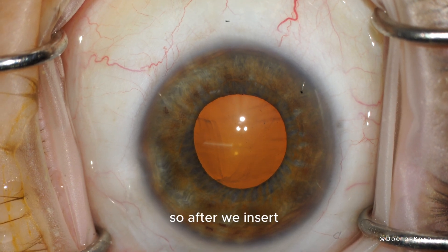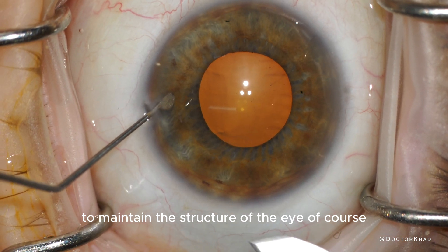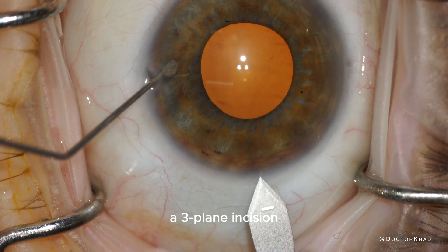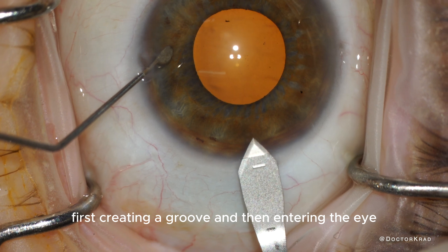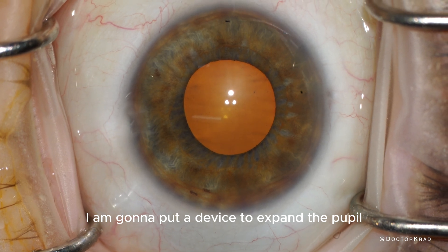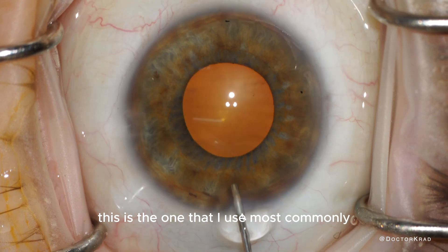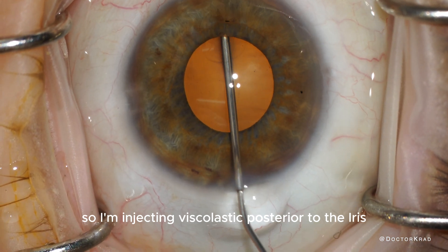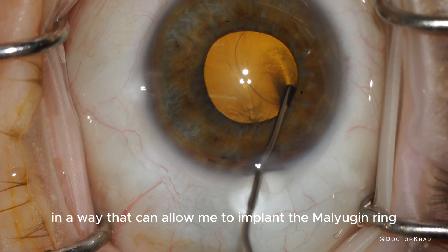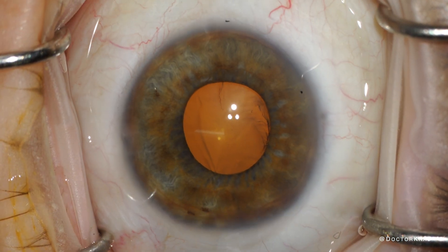After we insert numbing solution in the eye, viscoelastic gel to maintain the structure of the eye, we make a three-plane incision — first creating a groove and then entering the eye through that groove. I'm going to put a device to expand the pupil, called a Malyugin ring. I'm injecting viscoelastic posterior to the iris just to elevate it up and position it to allow me to implant the Malyugin ring most easily.